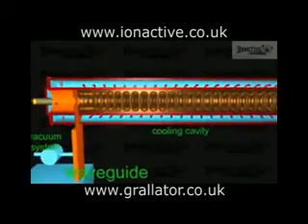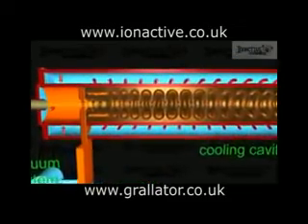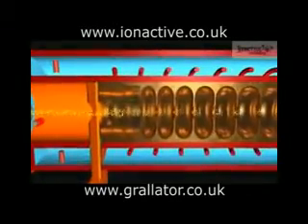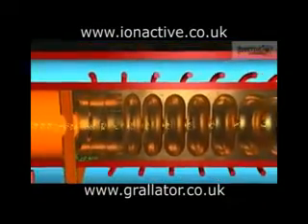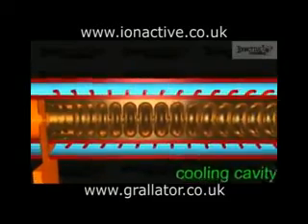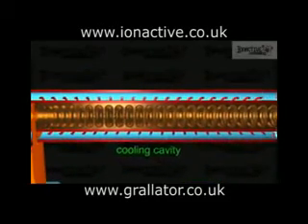The speed of the wave in the waveguide is determined by the cavity geometry and the size of the holes separating the cavities. The first few cavities are smaller and have larger holes, and it is in these sections that the beam is bunched and accelerated to relativistic velocities. In the remainder of the accelerator, the energy largely goes into increasing the electron's relativistic mass, so that the sections are uniform.